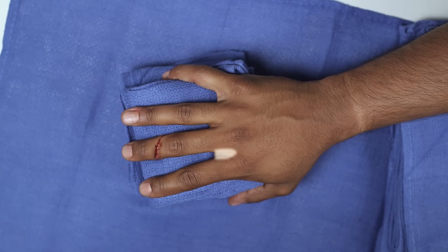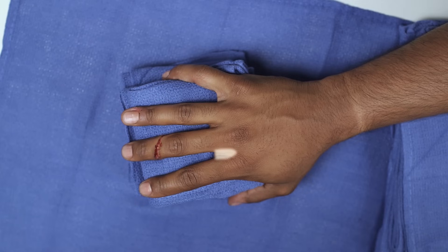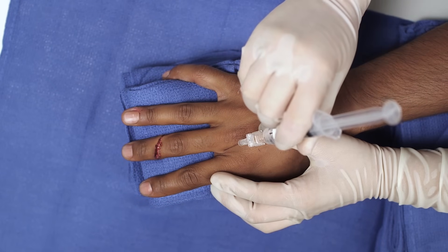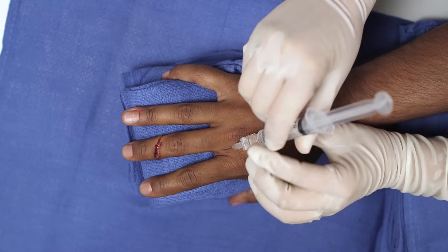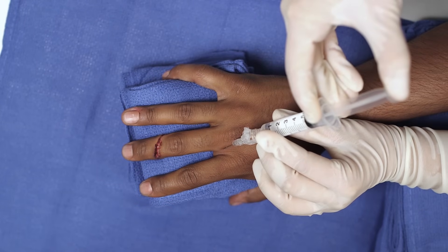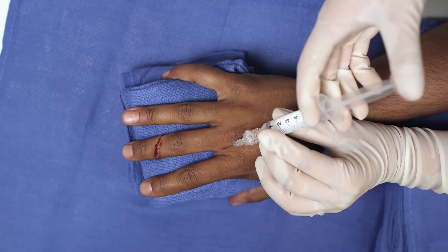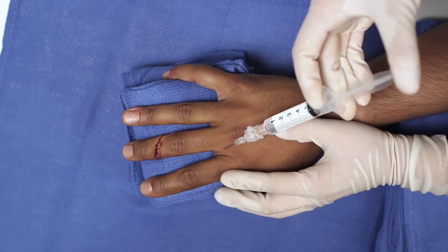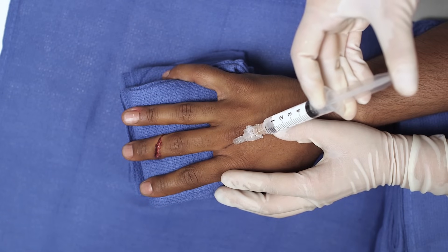Identify the web space on the dorsal aspect of the hand, where the finger joins the hand. Insert a 25- or 27-gauge safety needle at the web space and advance it until the needle reaches the palmar aspect of the hand. Be careful not to exit the palmar skin. Inject 3 cc's of local anesthetic while withdrawing the needle. This helps distribute the anesthetic, reaching both nerves in the process.